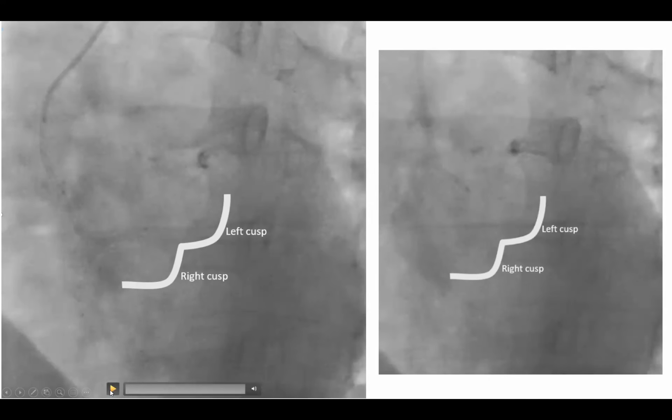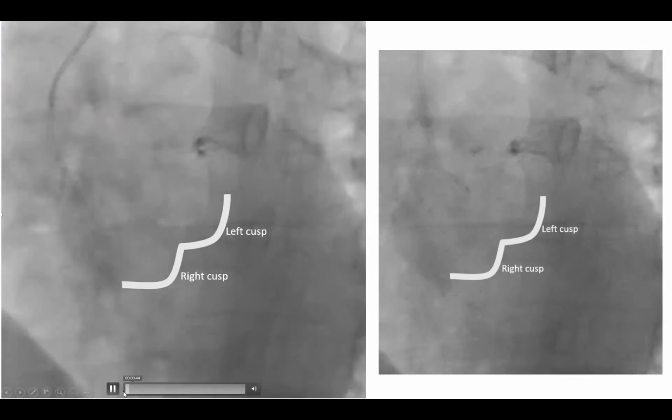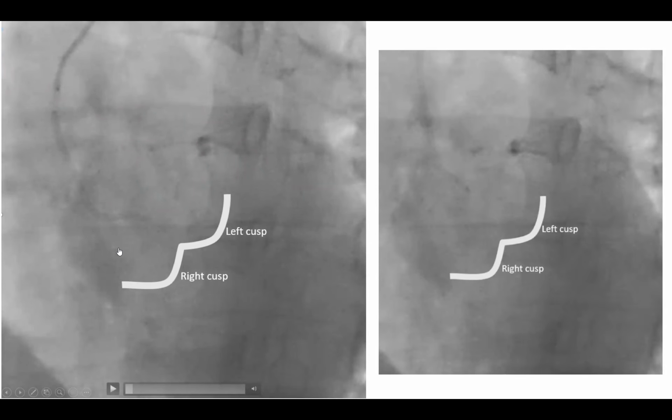This is another case here, and I'm illustrating to you how to engage. All those cases are basic cases that dissect the minutiae of how to engage the left coronary. So this is a Jackie catheter. It fell in the right cusp. Let me start here. So this is a Jackie catheter. We advance it over the wire onto the right cusp. Now our goal is to get to the left cusp, then to the left coronary, okay?